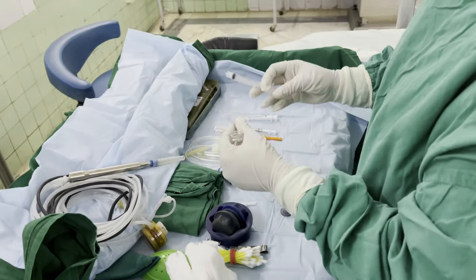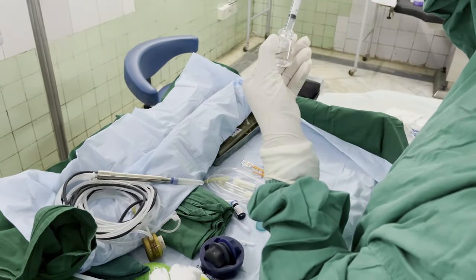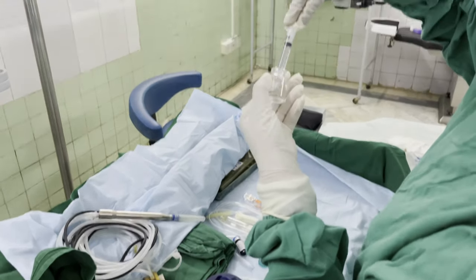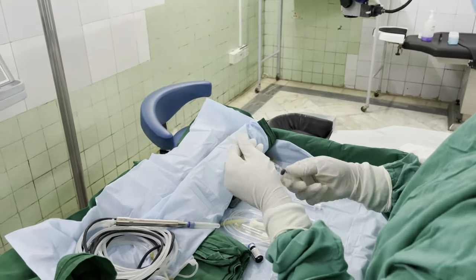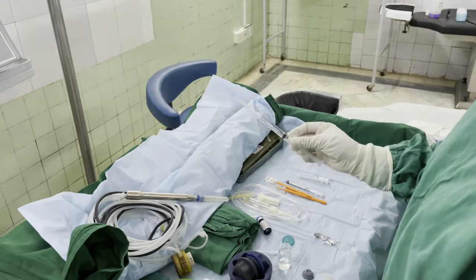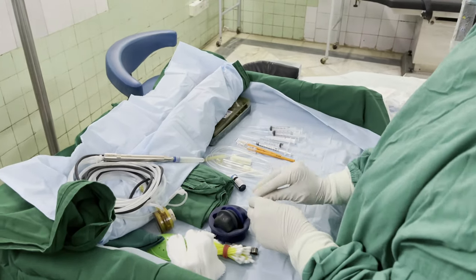At our institute, we use one vial of viscoelastic, which is drawn out for every case. We tend not to move our syringes from one table to the other. This is the viscoelastic. It's been filled in the syringe along with the ready cannula, which will be used for injection. Now we move to how sister prepares the blue dye injection.